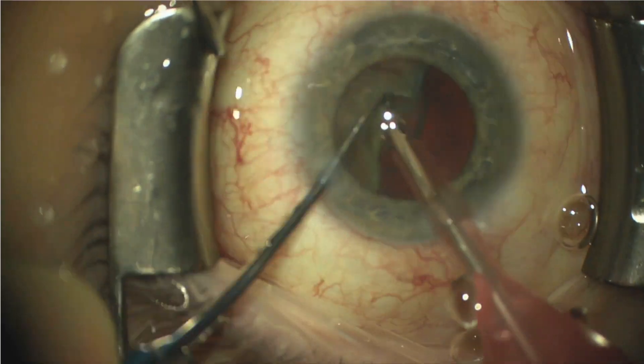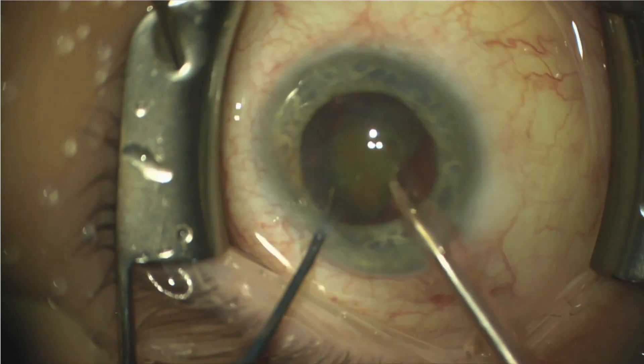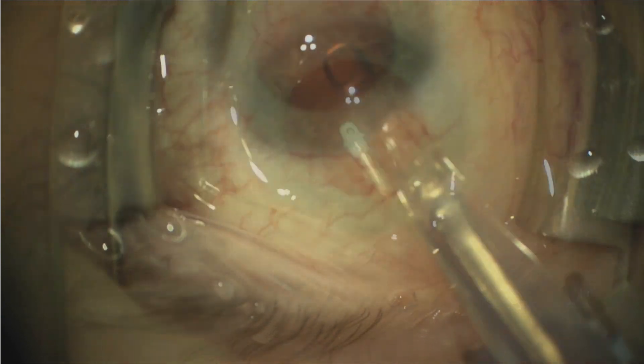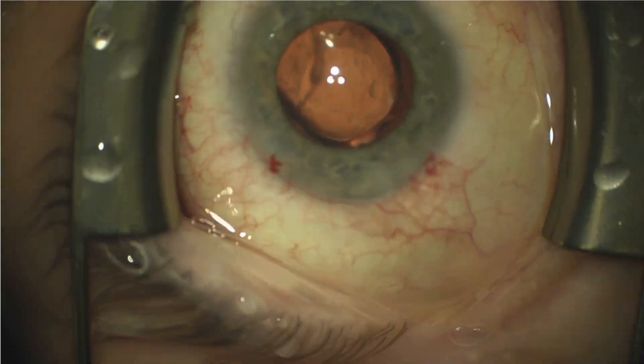From this point forward, the cataract surgery removal is pretty routine. We segment the lens into quadrants, followed by removal of the cortex, and a Vistа lens 21-diopter IOL is placed in the capsular bag.